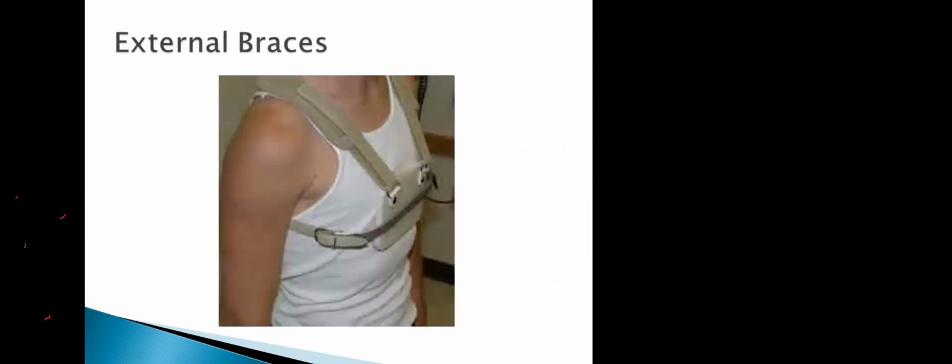We have different varieties of braces. The cheapest one you get in the UK is around 1,500. Costly ones are 3,800. They all are similar. What they do is just keep pressing your sternum. And then if you're young enough and elastic enough, they stay there. And once you stop growing and remove the braces, the chest looks amazing.